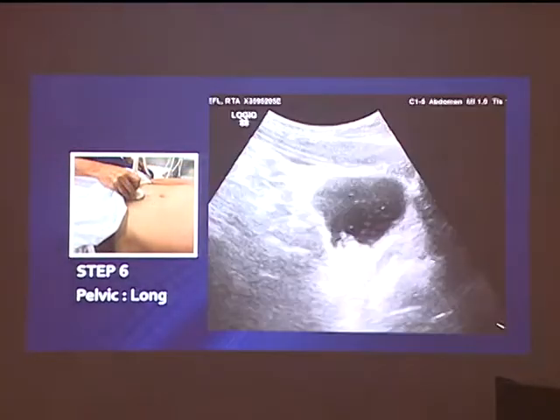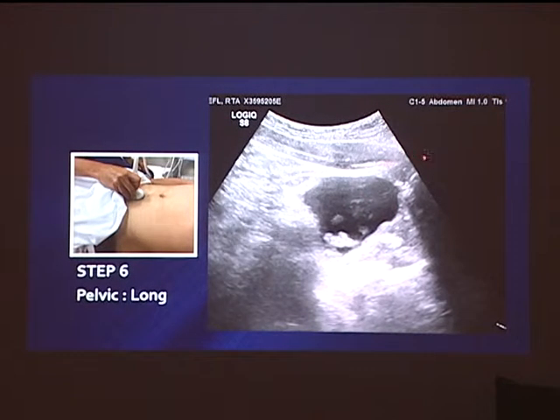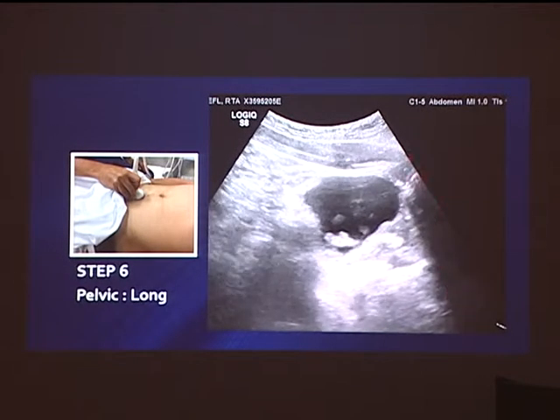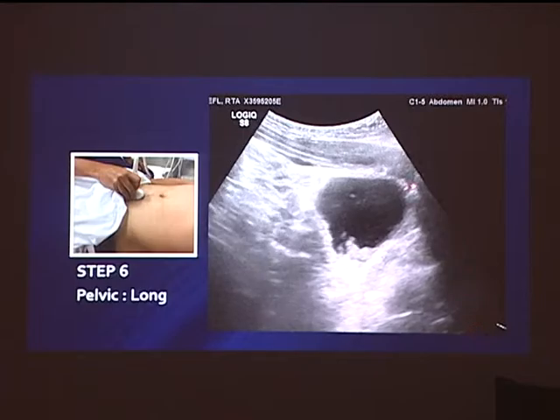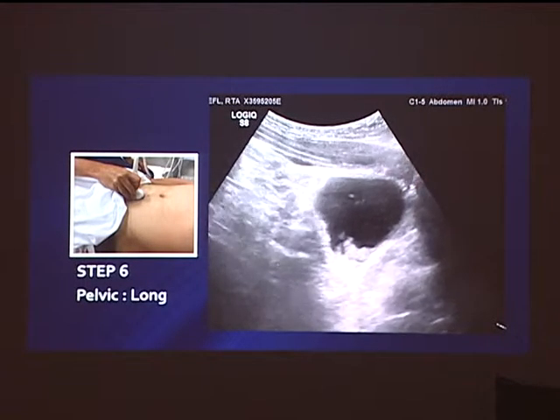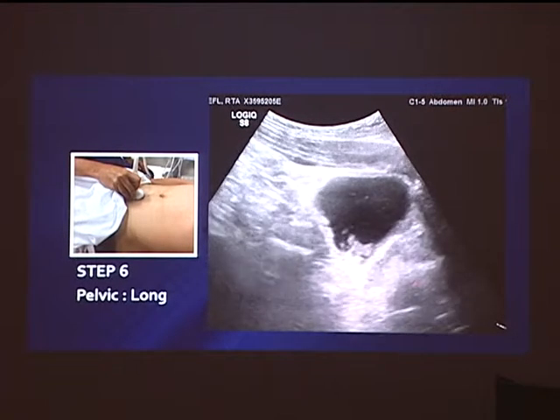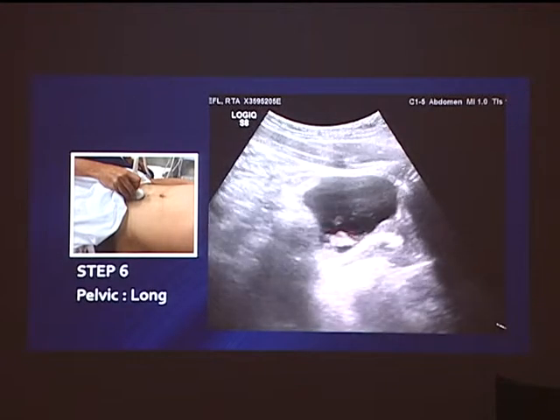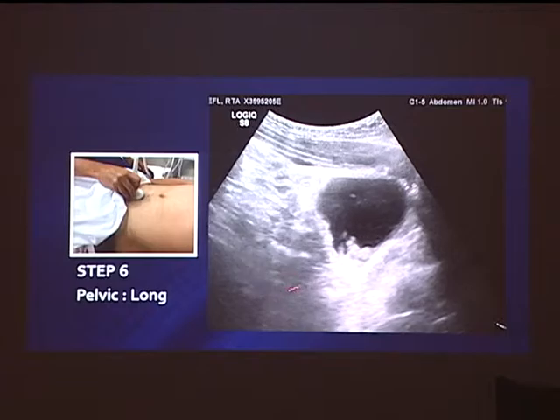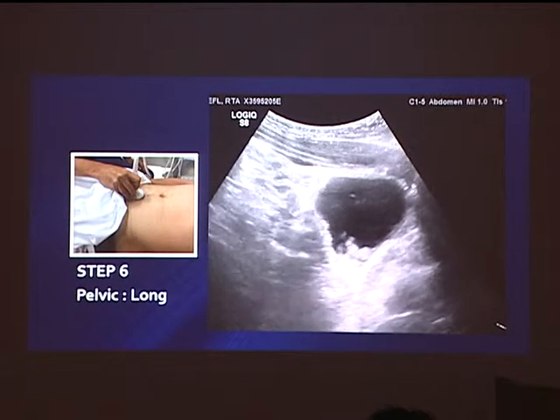Another patient — is there free fluid? This is a male patient. There's a shadow from the pubic symphysis, a distended bladder, and bowel — there's no free fluid outside. All these echogenic structures inside are blood clots. This patient had no abdominal trauma but suffered from hematuria, and what we see on the scan are blood clots inside the bladder, but there's no free fluid outside.